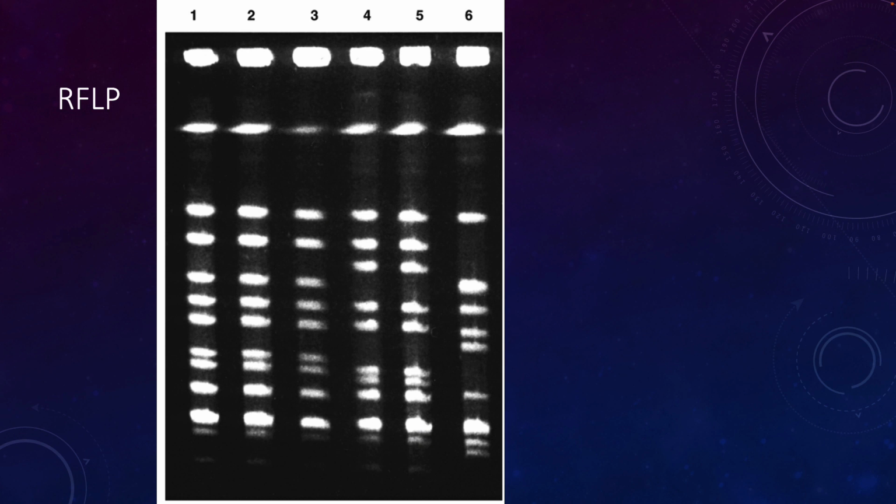So this is a quick and easy way to identify an infection. This is also commonly used in tracking outbreaks. So where did the disease come from? Did it come from, like in the food chain, right? So if we talk about spinach that has E. coli O157:H7, did it come from the packaging facility? Did it come from the transport? Did it come from the field? Like, where did it come from? These types of assays are really good for that.